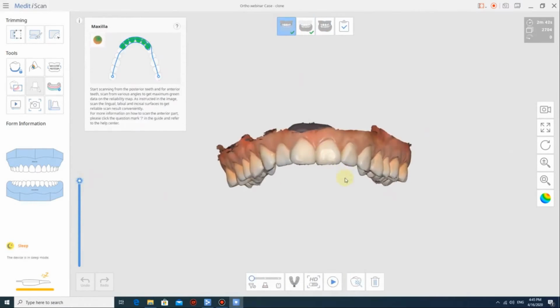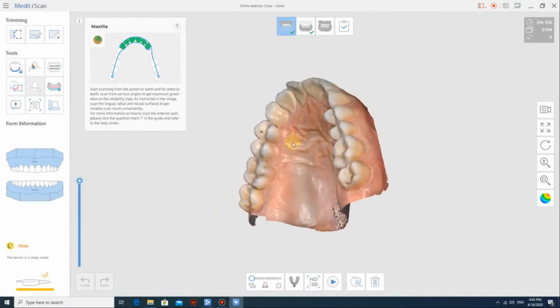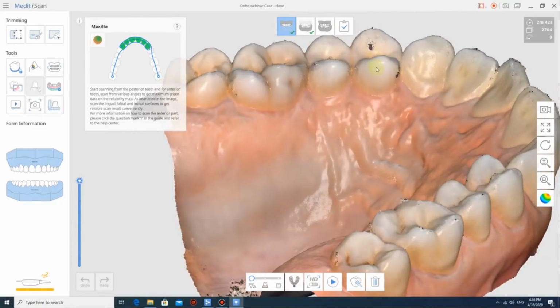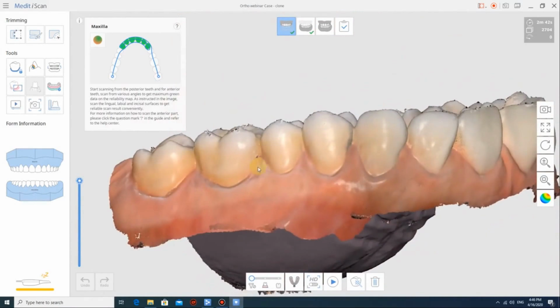But wherever you scan the interproximal areas, okay, specifically here and also here, but also here from the buccal side, always you minimize that on 12, 13 regarding your scanning technique, okay? But always we need to make sure that the light won't go further than that in order to protect our scanning from capturing unnecessary data like the tongue, the cheek, etc.